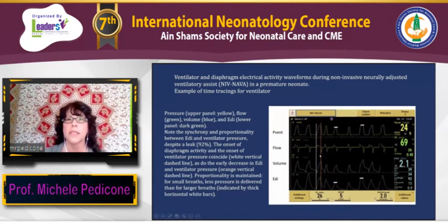Look at how synchronous this is. Even when the patient is taking a small breath, the EDI is supporting at a lower amount. Conversely, if the patient is requiring more, the EDI is delivering more. So again, this shows the synchronicity of this particular mode of ventilation and how it responds and correlates very well with what the patients are doing.